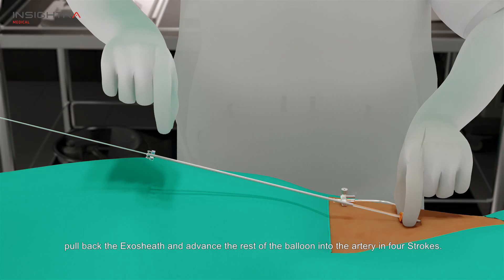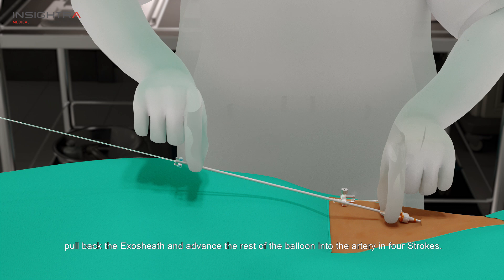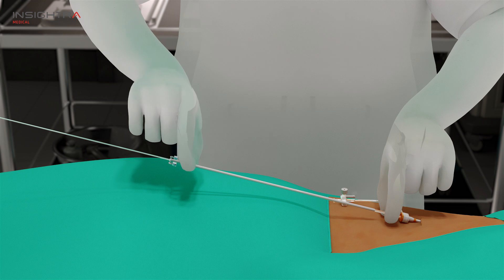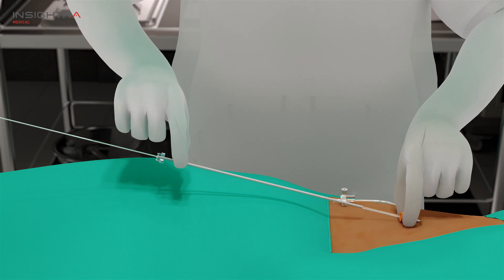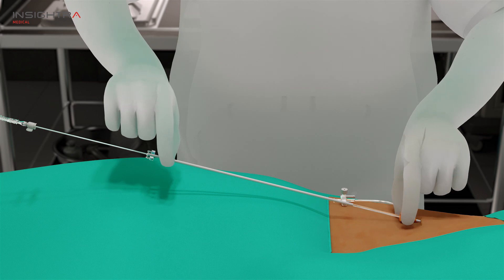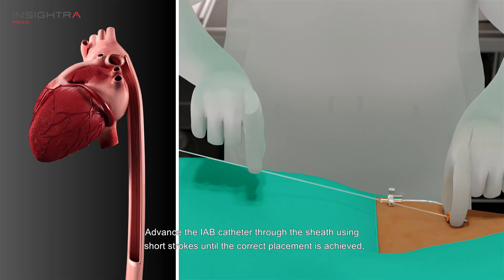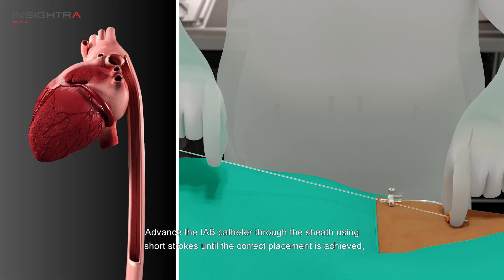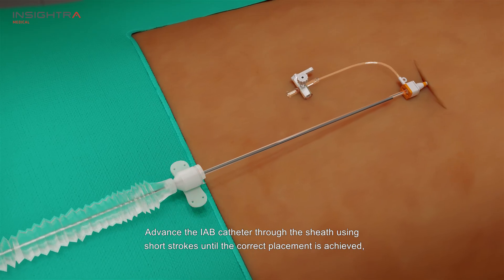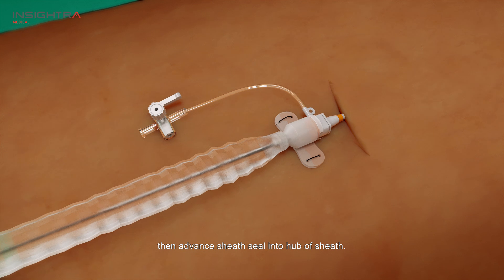As the balloon tip is inserted, pull back the exo-sheath and advance the rest of the balloon into the artery in four strokes. Advance the IAB catheter through the sheath using short strokes until the correct placement is achieved. Then advance the sheath seal into the hub of the sheath.